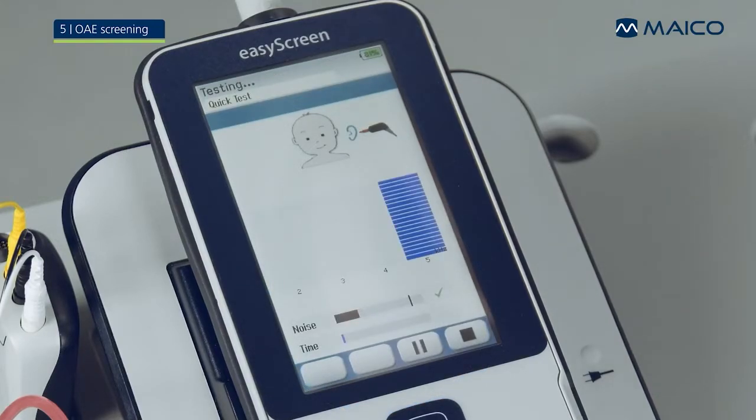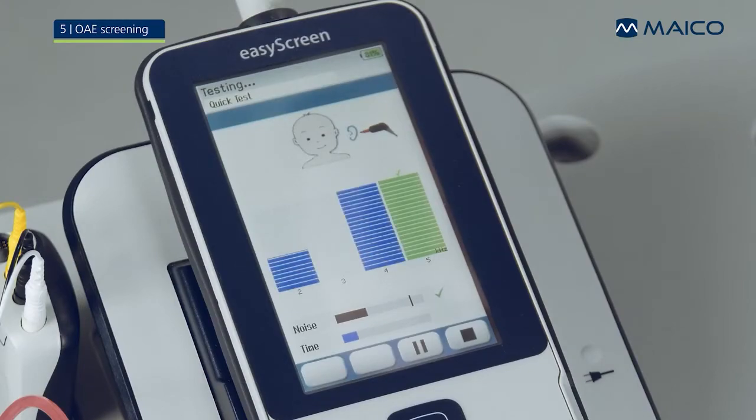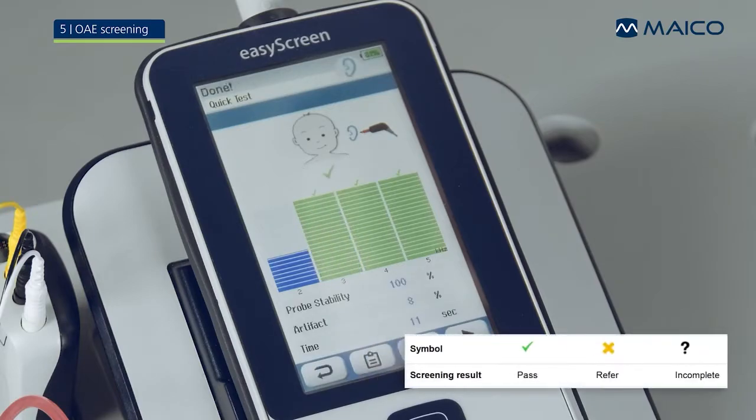Vertical bars for each test frequency display as the measurement progresses. The bars will be blue for a left ear test and red for a right ear test. If a frequency is passed, the bar will turn green and a check mark will be displayed above. After the screening is completed, the result will be displayed.